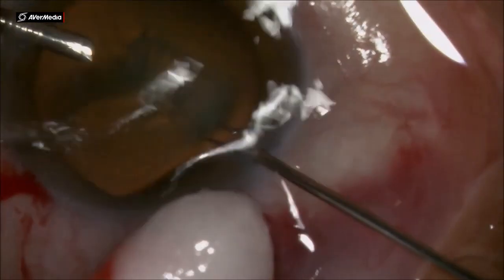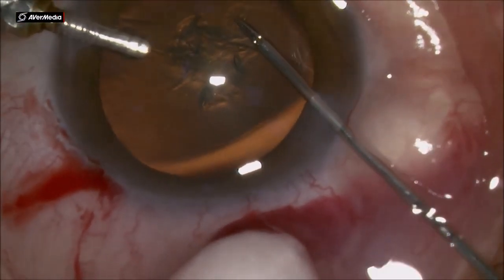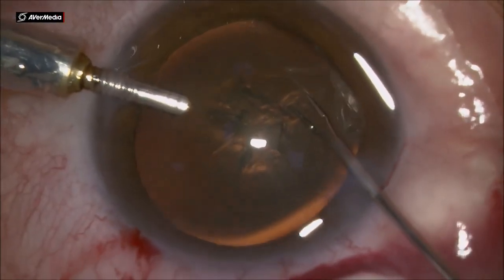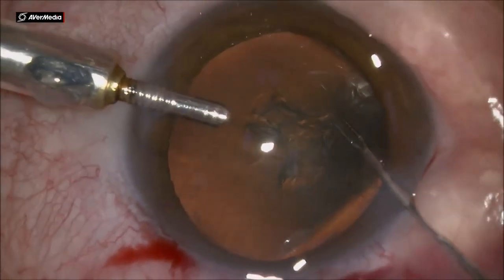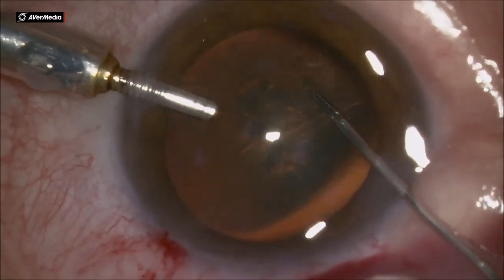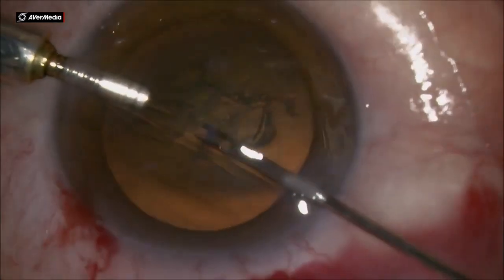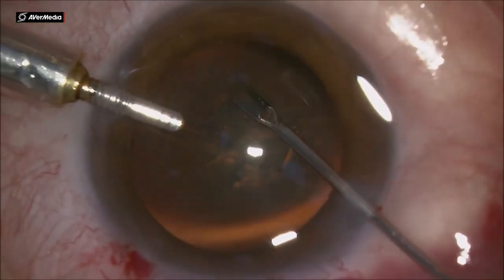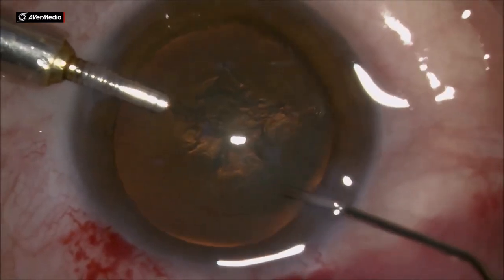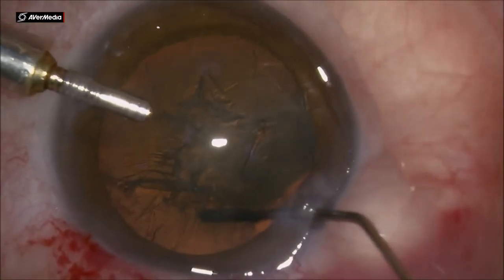Finishing up, the capsulorhexis should not be left under the main incision from which you do the capsulorhexis, because it's harder to reach, but we are able to finish the capsulorhexis, enlarging it a little bit there on the 6 o'clock area, and then using a cannula we do the hydrodissection and hydrodelineation.